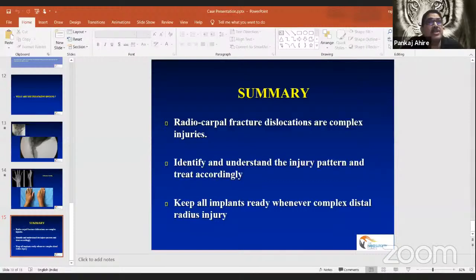And in this case, it looks like a dorsal rim fracture. I would have definitely done a dorsal fixation for these. Any other comments? Once we elevate that articular fragment with K wires, we have incorporated those K wires into the fixator so that they don't back out. I'm not sure from where those K wires are going. I'm really scared of putting anything percutaneous around the extensor tendons, 100%. If this has worked for you, fantastic. I just gave my opinion to start a discussion.